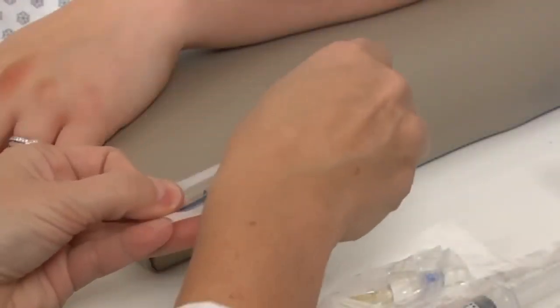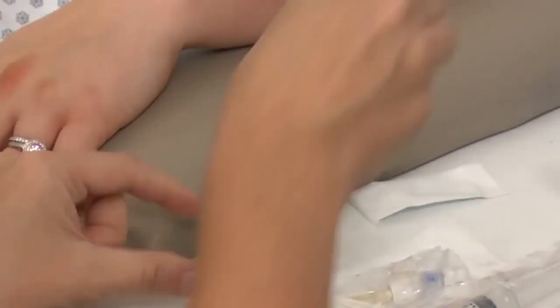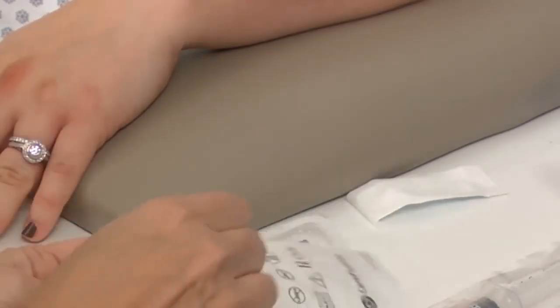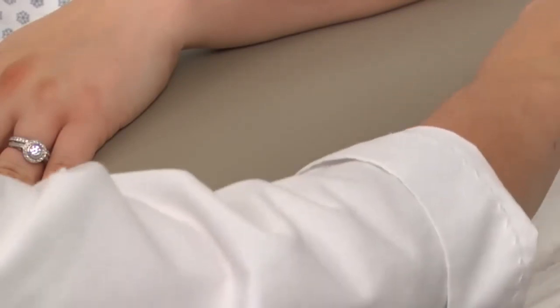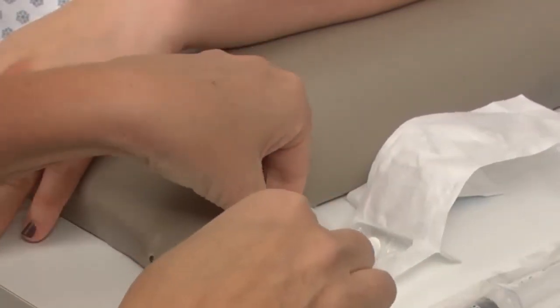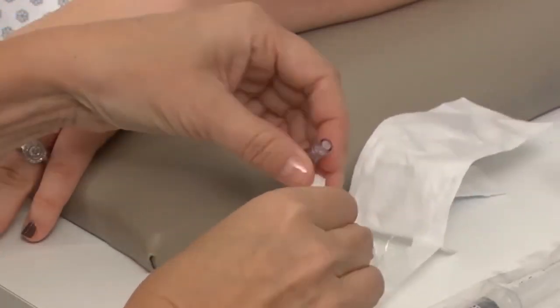Open all of the materials, maintaining aseptic technique. Having a garbage can close by will help decrease clutter. You will then need to connect your pieces. Remember to avoid touching the ends.